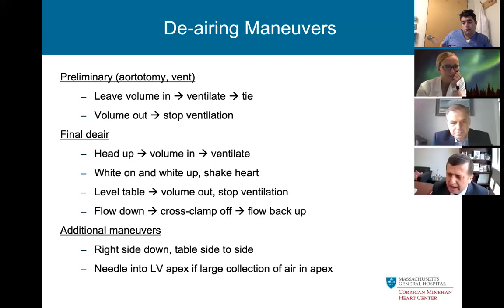Great, thank you. You're talking about the head up with the clamp on? Yeah. I do that to push the air out into the root, and then after the air gets sucked out from the root, I level the table or head down, and then I take the clamp off. So it's additional time for the air to go into the root and get sucked into the vent.